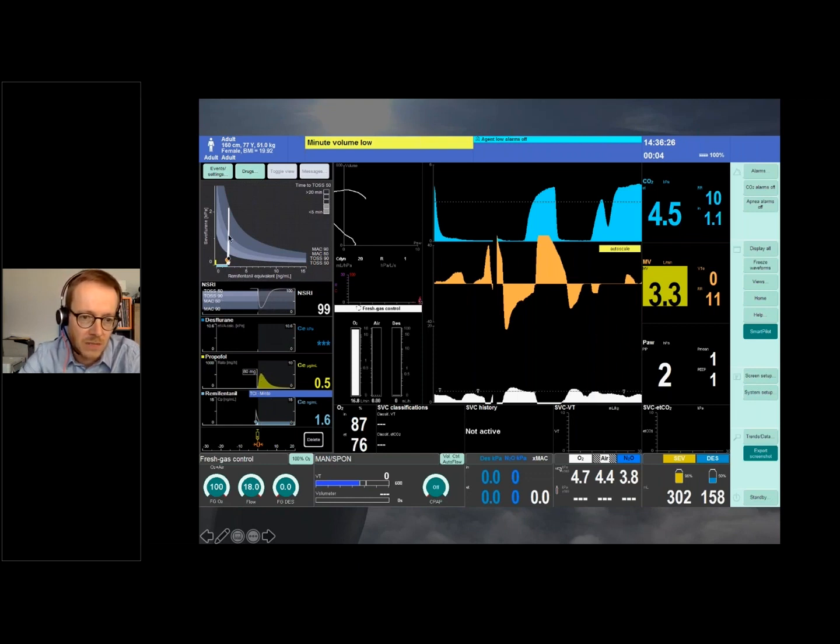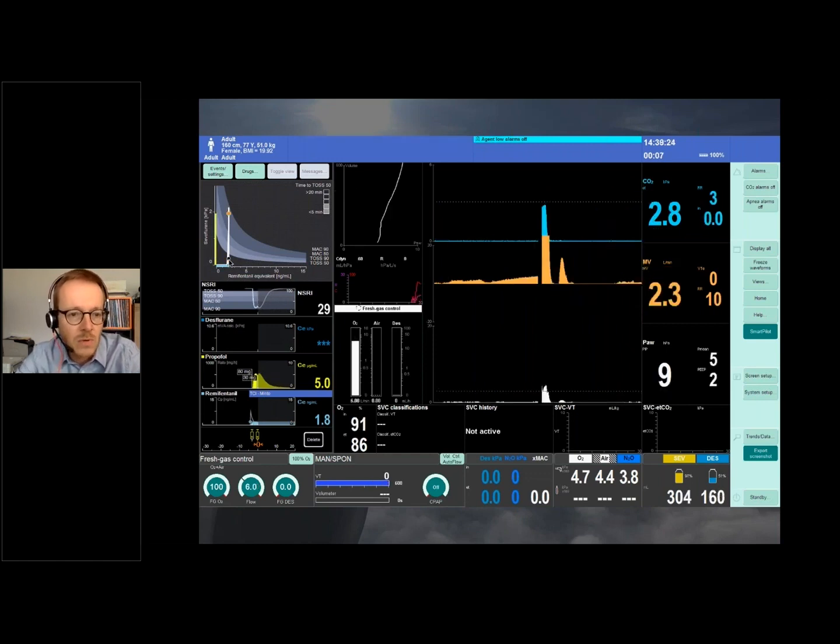And you see here, we give only 80 milligrams. We are now the orange dot, and if nothing happens, in 10 minutes we will be right here again. So if nothing else would happen, in 10 minutes the patient would definitely be awake again. So before we intubate her, we give a small extra dose, 30 more milligrams. In the meantime, we have reached our set target for remifentanil.